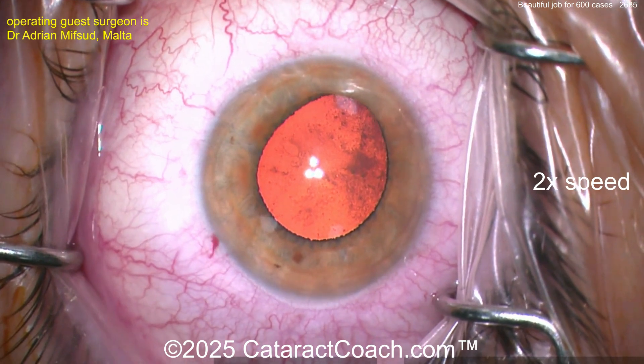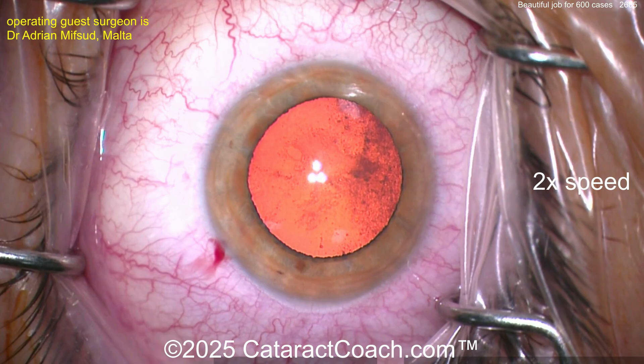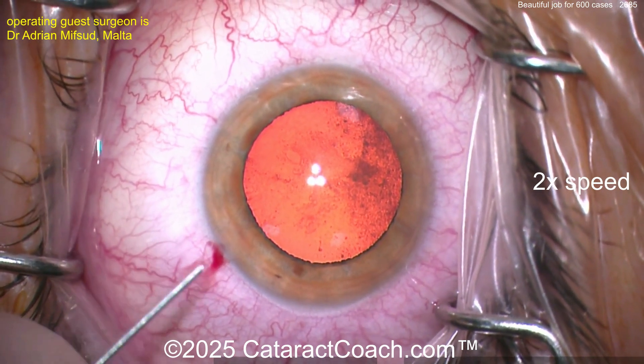Putting in some anesthetic — it's lidocaine, epinephrine, phenylephrine. Look at that pupil expanding right in front of your eyes. I like that. That was very effective.